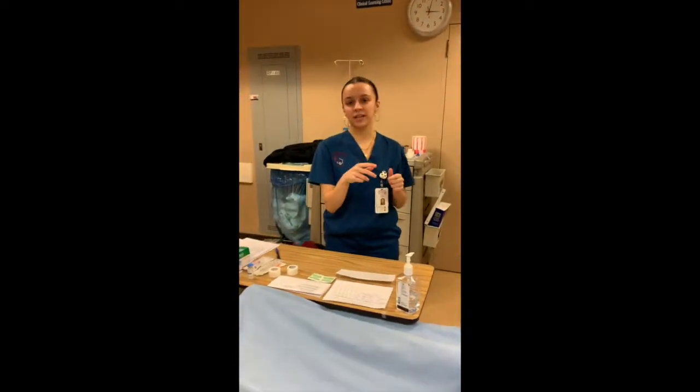Okay, so we need to indicate whether we need to use a larger needle or a smaller needle, and our barrel size, with intramuscular and subcutaneous injections. So for subcutaneous, you're going to be using a smaller needle, and the needle length is going to be around 0.38 to 0.63 inches. As for the gauge, it's going to be around 25 to 27, just because with subcutaneous you're going to be injecting into a fattier area. And for intramuscular, you're going to be using a larger needle with a smaller barrel, and the gauge is going to be around 20 to 25, whereas the needle is going to be 1 to 1.5 inches. You use a longer needle just because you're penetrating through muscle, ensuring that you're getting the medication all the way through.